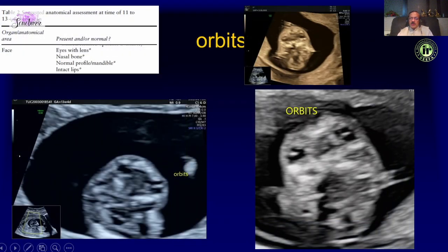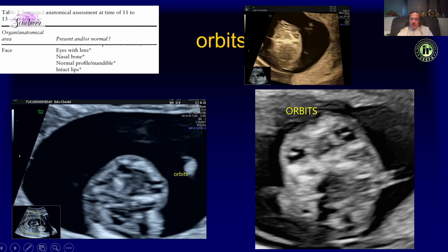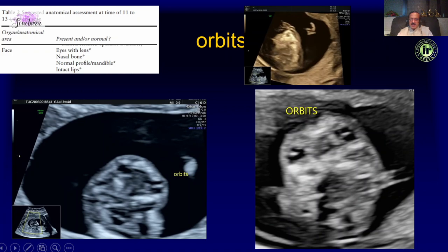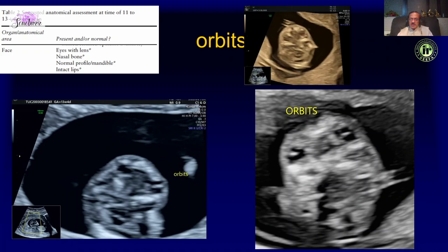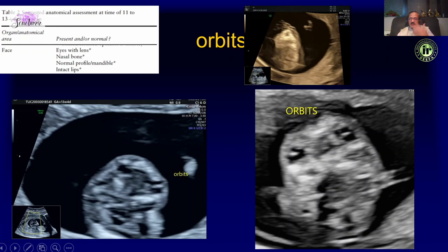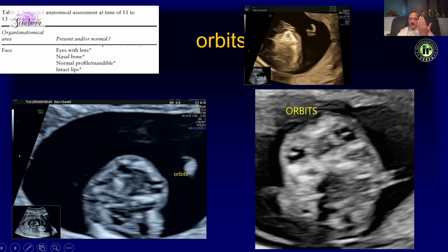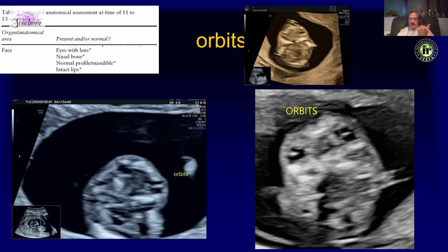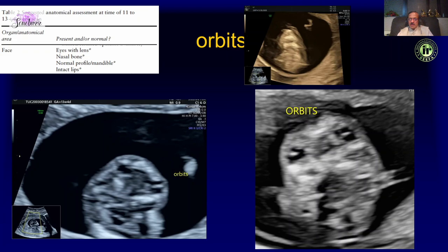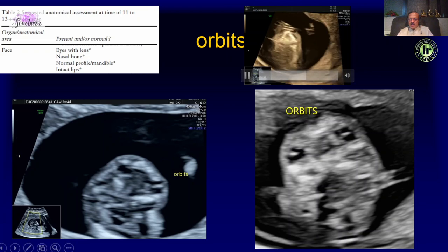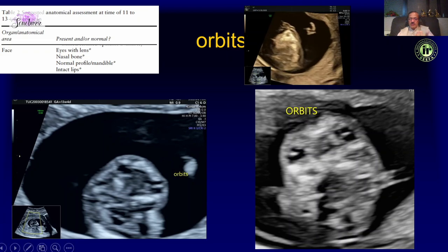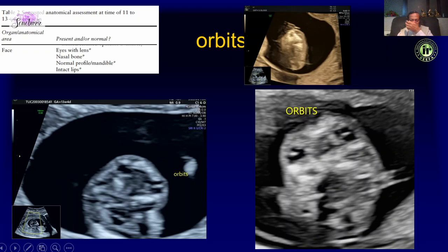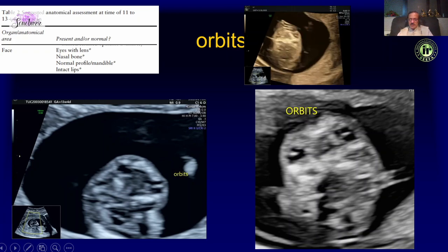The ISUOG guidelines also recommend looking at eyes and lens. In the same axial plane used for the head, we can go down to look at the orbits and go further down to look at the alveolar ridge of the maxilla.